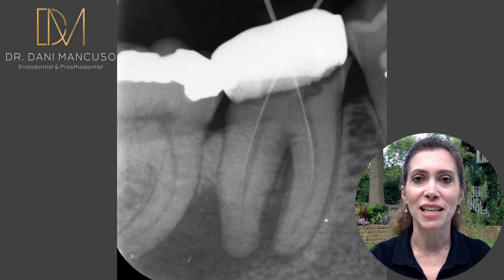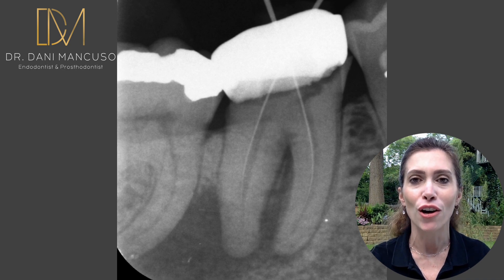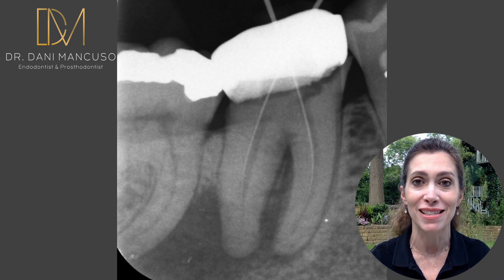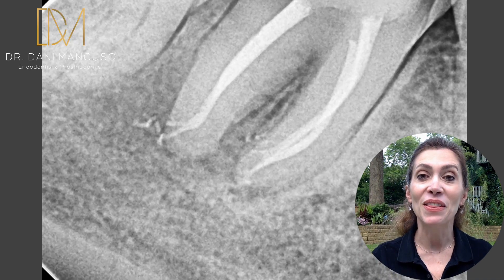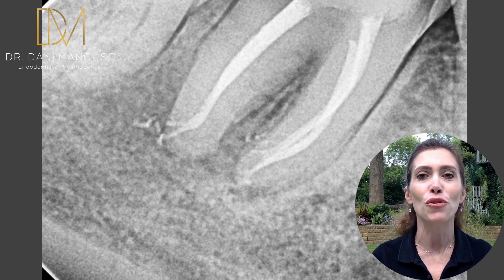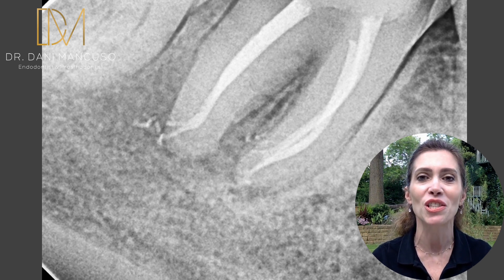If you remember that case I showed you in the previous episode with the large peri-radicular radiolucency, and then the lateral canals and the obturation of that tooth — the healing is starting.